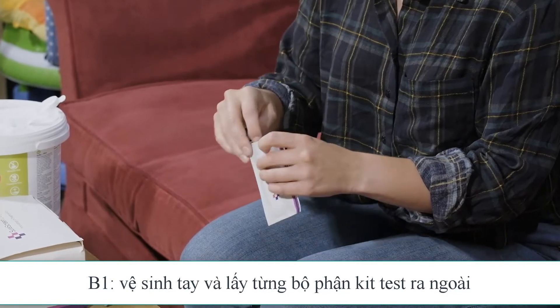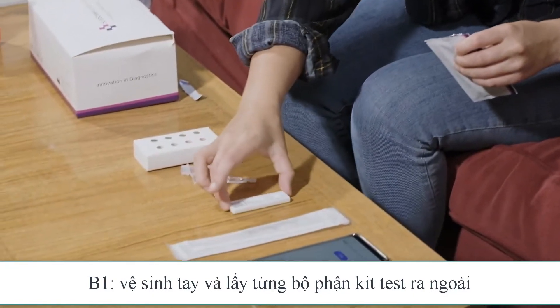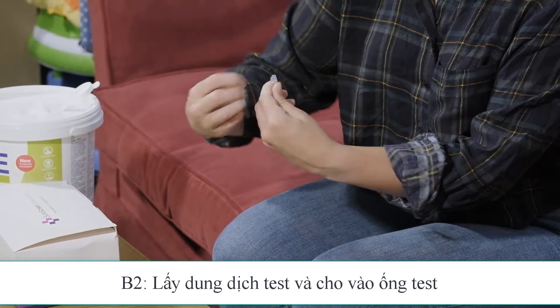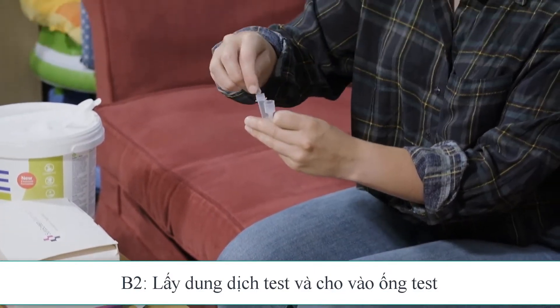Open the cartridge packet and place the cartridge flat onto the clean surface. Pick up the buffer solution vial, twist the top to open, and add all of the solution into the extraction tube.